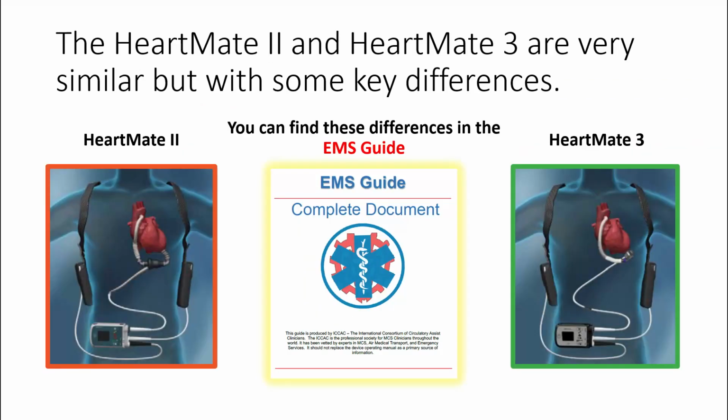Now, here's a really neat thing, or a really important thing. The HeartMate 2 is by far the most common LVAD out there, but I think last year, or maybe late the year before, the HeartMate 3 came out. So that is out there as well. It has the green background. As you see the border around here, it's also in the guide. So if you have an older version of the guide, which I think came out in 2016, it doesn't have the HeartMate 3. They're very similar.